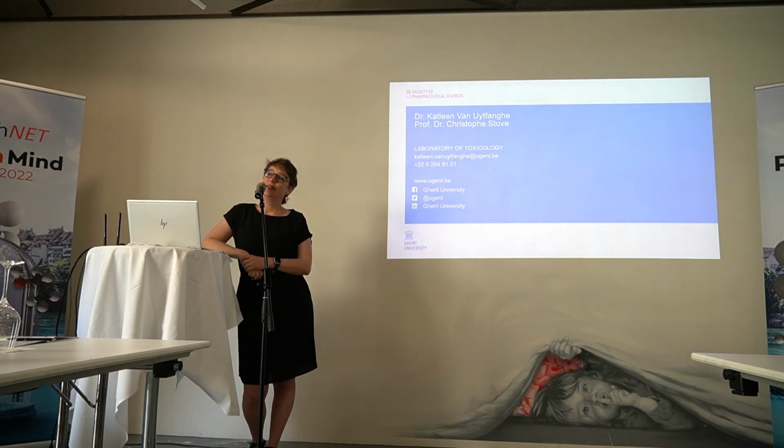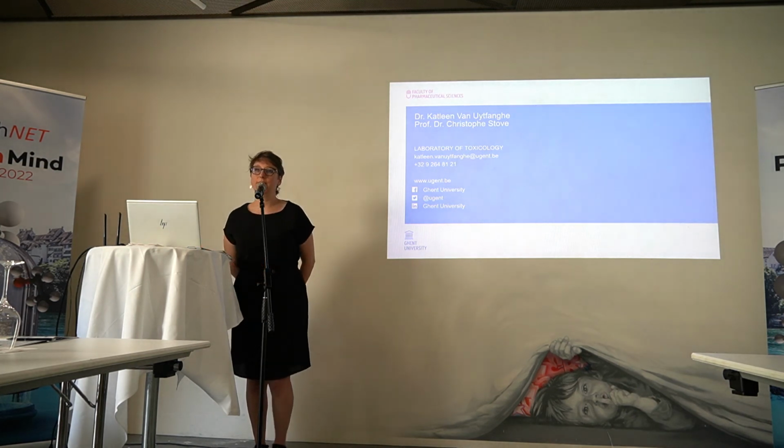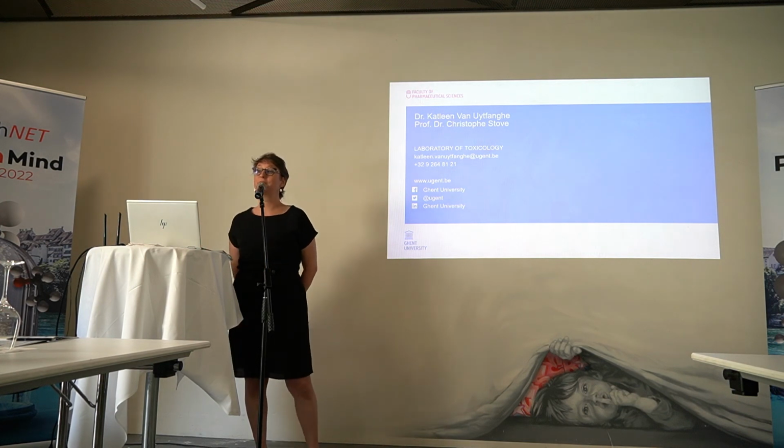As far as I know, the only reference material with blood currently is the one from ACQ Science. Is that correct worldwide? Or is that just a European feeling? We use the term reference material. It's a material which we can use as a QC material, which can be a secondary matrix-based reference material.